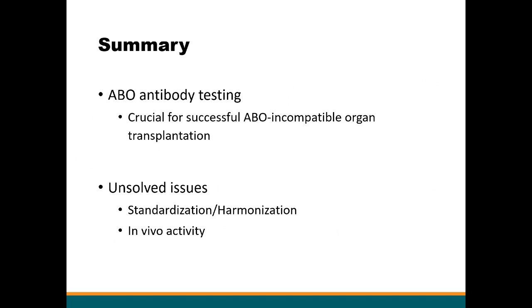In summary, ABO antibody testing is crucial for successful ABO-incompatible organ transplantation. But there are many unsolved issues, and we need to further advance our test methods to overcome these issues.